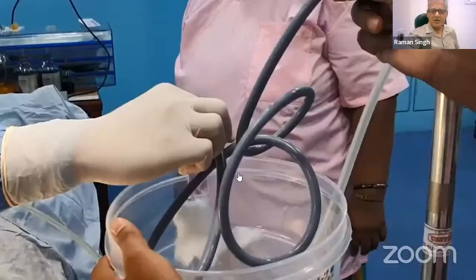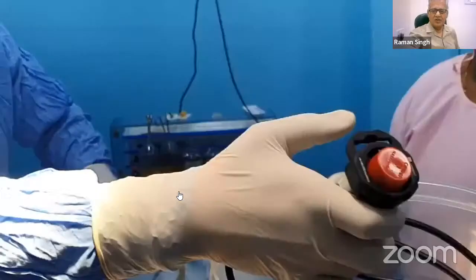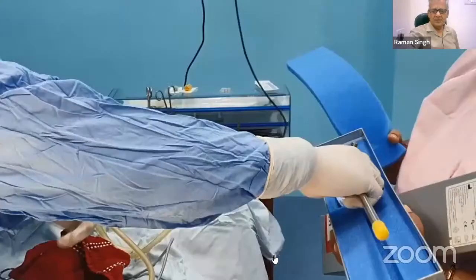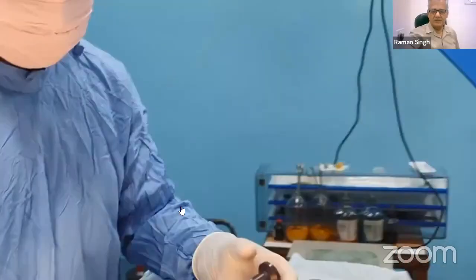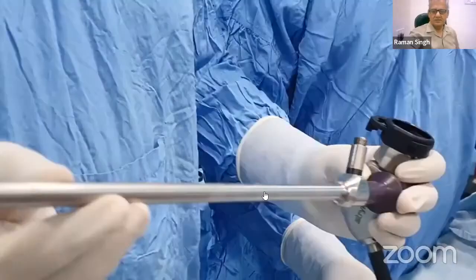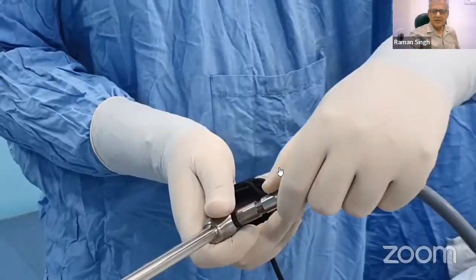They are all preparing, they are taking all the instruments from the cabinet. Before going to surgery, you should prepare all your instruments and check whether they are working properly or not. So after getting all connections ready and all the instruments ready over the operation table, this is the telescope attached with the head, as I told you. And now this is the light source. We attach it over the telescope.